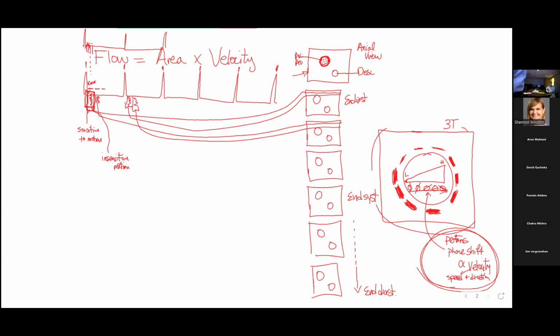So we don't lose too much, but it is about half of what we would do for the cine maps. And so you collect these images kind of the same way that we did before. And if you have atrial fibrillation, remember AFib last week, you apply the same thing.